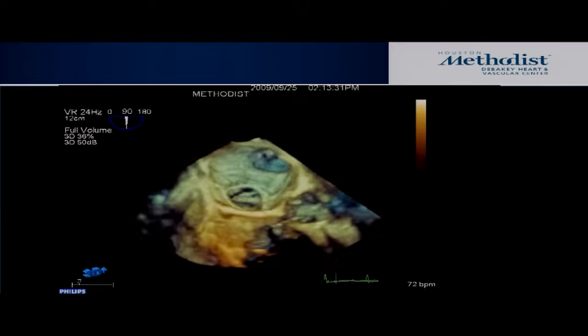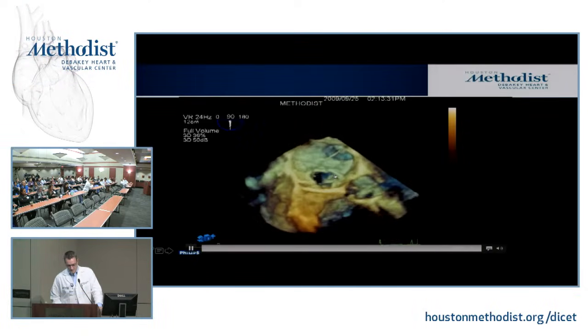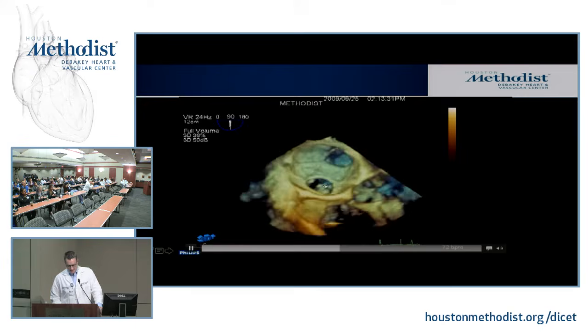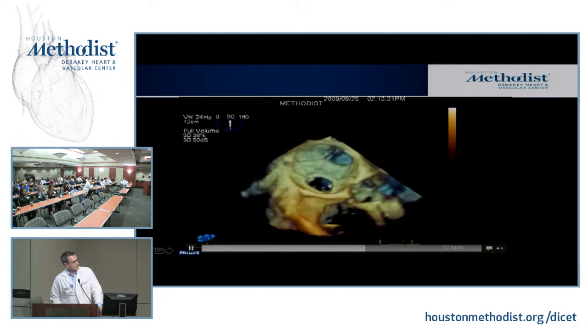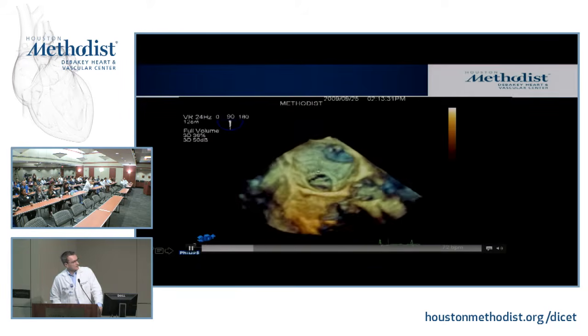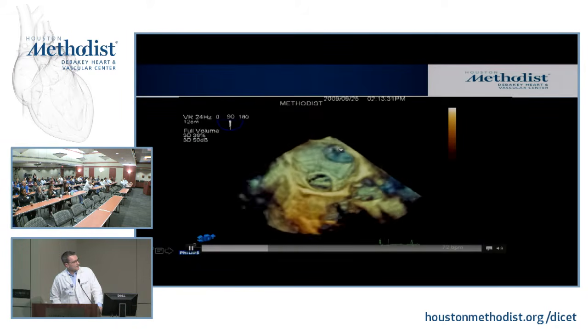This is a patient who was sent to us for concern about endocarditis. This is a patient post-mitral valve repair. There's the ring. This is the mitral valve. This is an atypical angle I'm showing you. This is the os of the left atrial appendage. This is the concern. This very long linear wiggler. Looks like a sort of dancing snake or something.